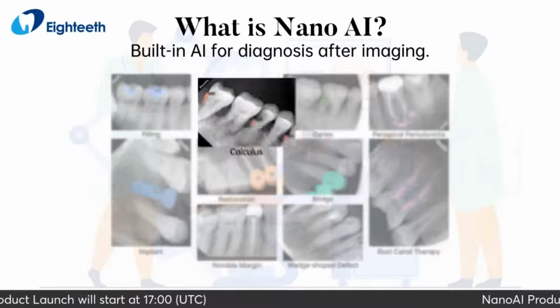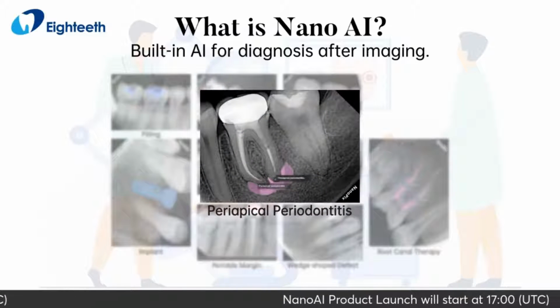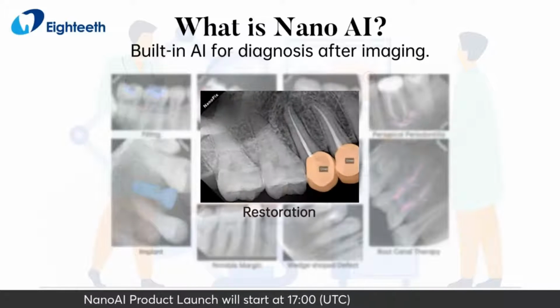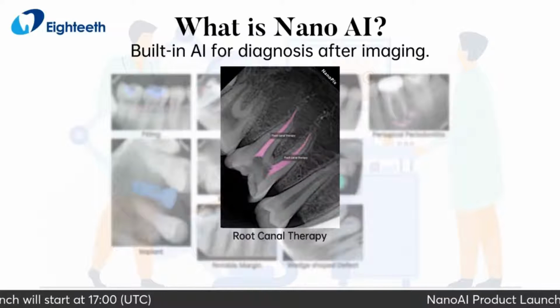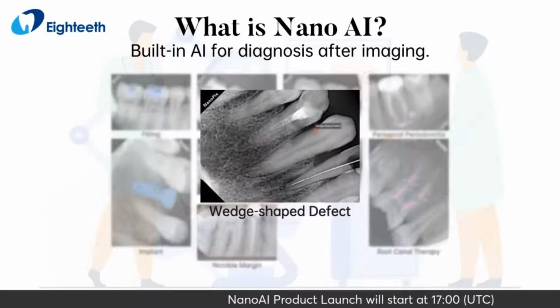calculus, caries, periapical periodontitis, implant, restoration, bridge, root canal therapy, notable margin, and wedge-shaped defect.